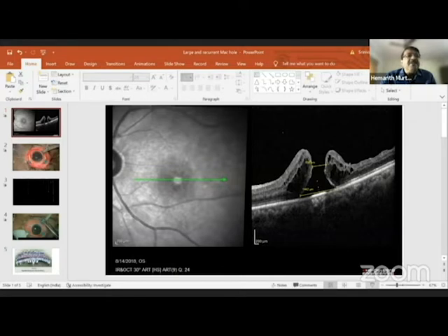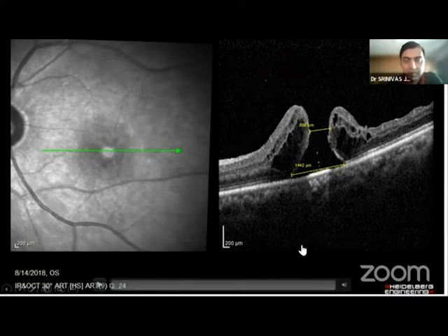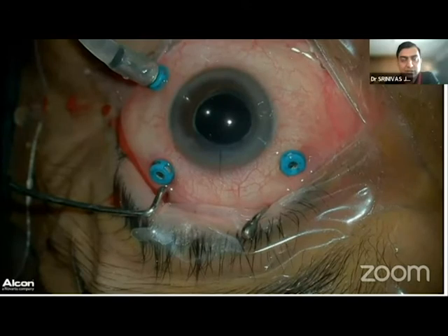Okay, that's fine. So I'll be sharing 4 cases. Sorry, this was a repeat topic which I presented at the last COSCON also, but I will definitely try to do justice to the topic allotted to me. So this was a case of a recurrent macular hole where ILM peeling was done previously, and then the patient was referred for the failed macular hole.